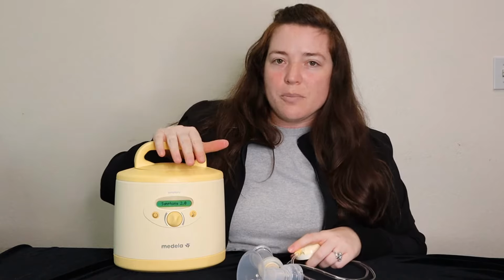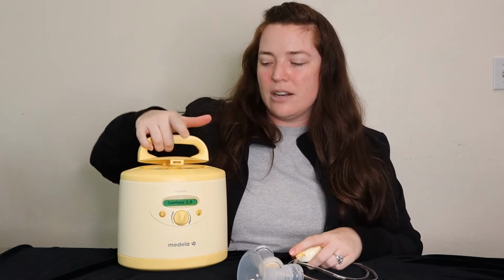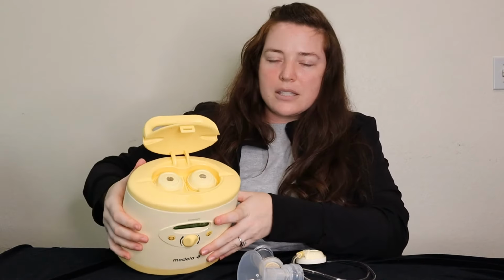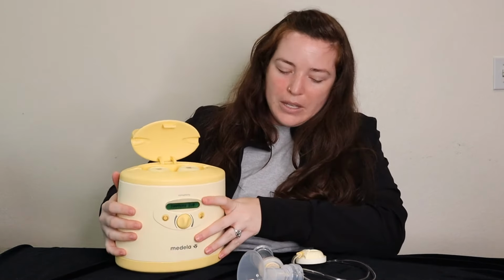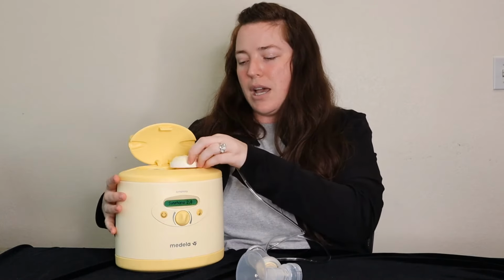So when it comes to using your pump, what looks like a little handle is a little bit of a door. So we're going to hit this button and it'll open up, and that's the working mechanism part of your pump. You can single pump or double pump, so one or both at the same time.